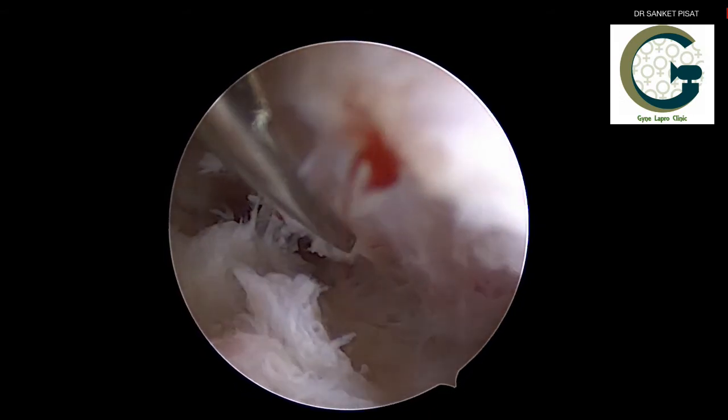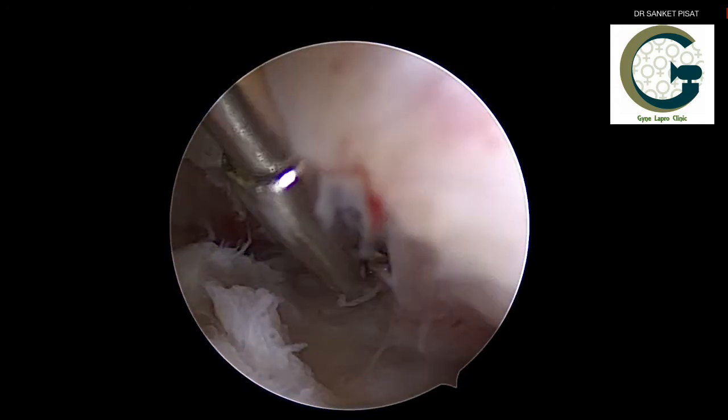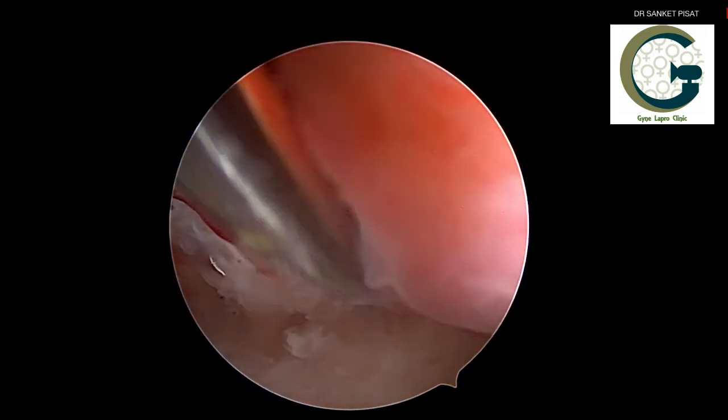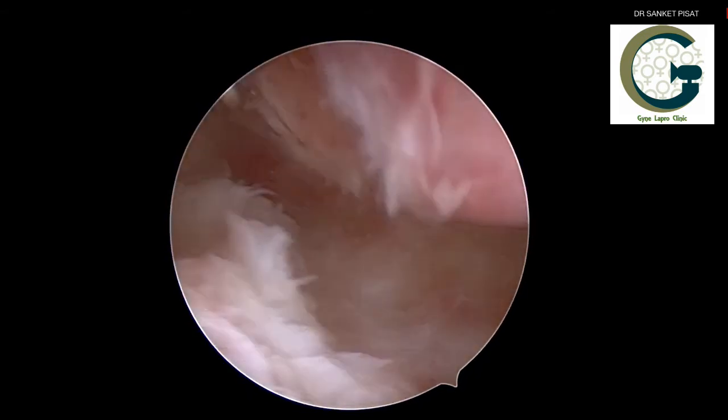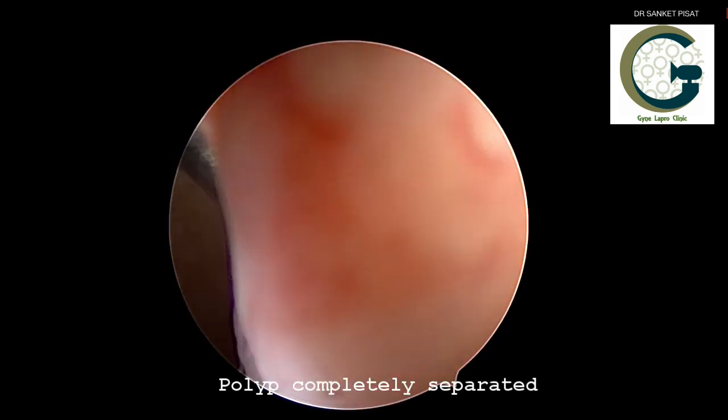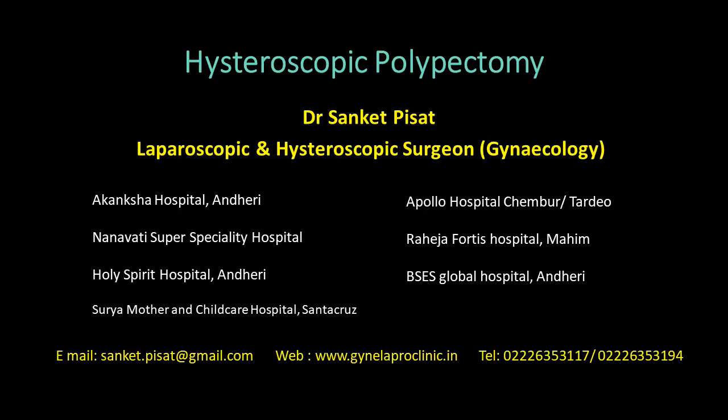As soon as the polyp is detached, the polyp can be removed from the patient's body either by using a hysteroscopic grasper or by other instruments available. Here we can see that the polyp is now completely detached from the uterus. Patient has immediate relief of symptoms and may even get pregnant without any support.